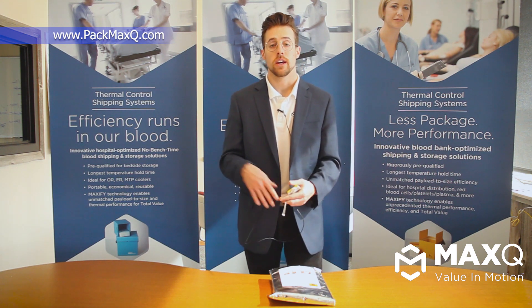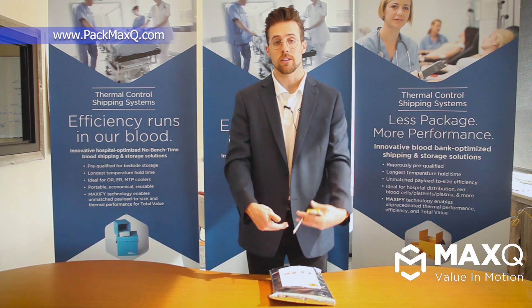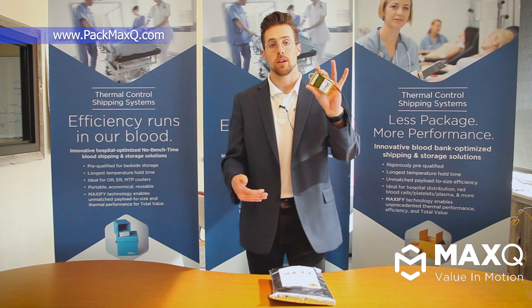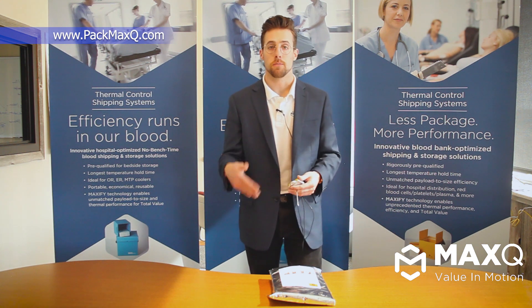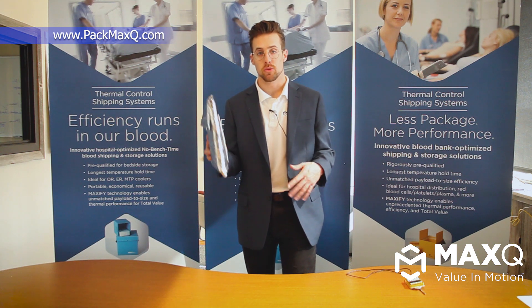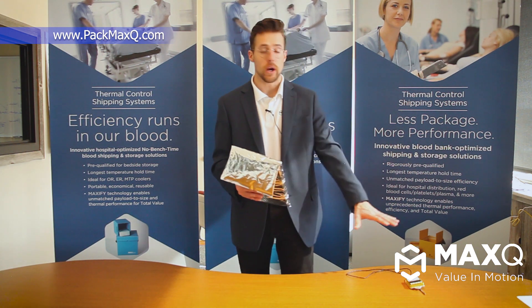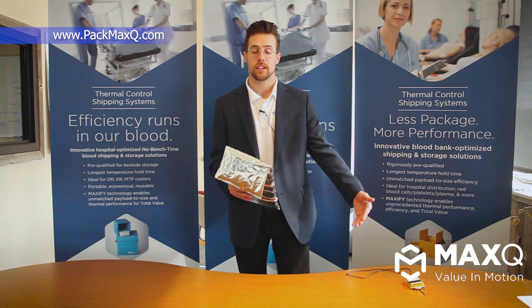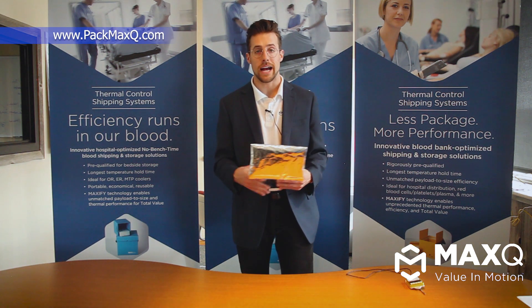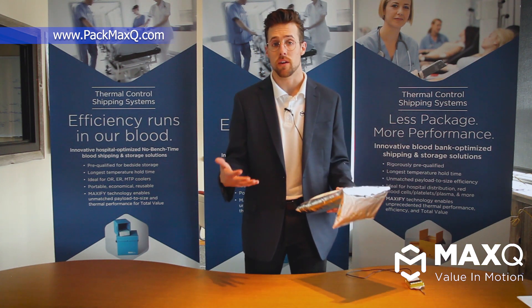Maybe the night before you intend to validate, go ahead and take your probe and your payload and put them in the refrigerator. The reason we do that is to make sure the data logger probe and the blood unit are at the exact same temperature when the test starts. You don't want to activate the pouch and then run to get your data logger — you want that blood unit with the data logger taped up and ready to go. Now that we know the preconditioning duration of three hours and how our payload and data logger should be conditioned, we can talk about how to actually activate the pouch.